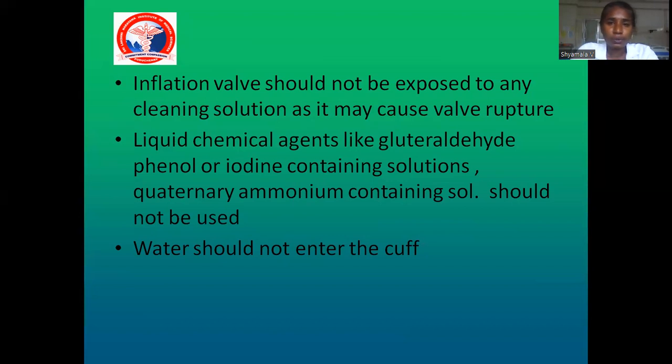Water should not enter into the cuff. These are all the important things while cleaning the laryngeal mask airway. You should not put anything into the inflating cuff, because the valve is there and it will rupture. Chemical agents like glutaraldehyde, phenol or iodine containing solution should not be used. And you should be very careful that water does not enter the cuff.